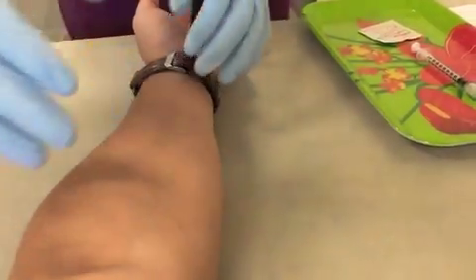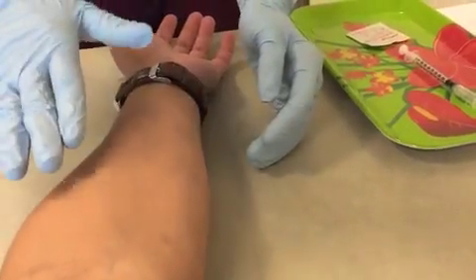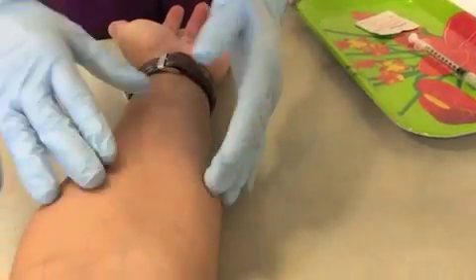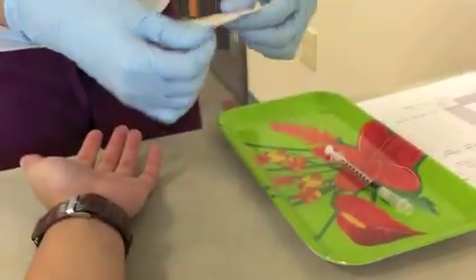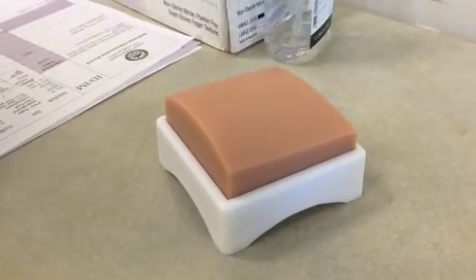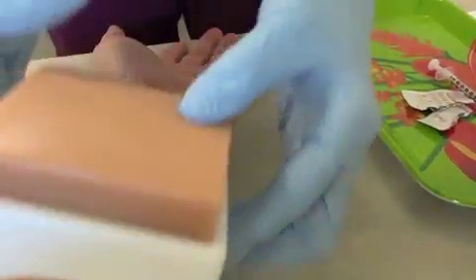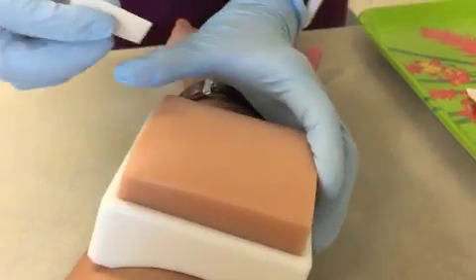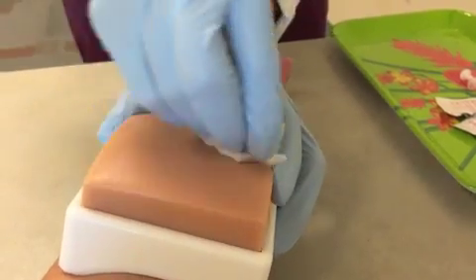So now you want to inspect the site. The ID goes in the forearm, and you want to make sure that it's nice and clean. And right here, perfect right here. So what you want to do is get your alcohol swab. You're going to clean inner to outer.